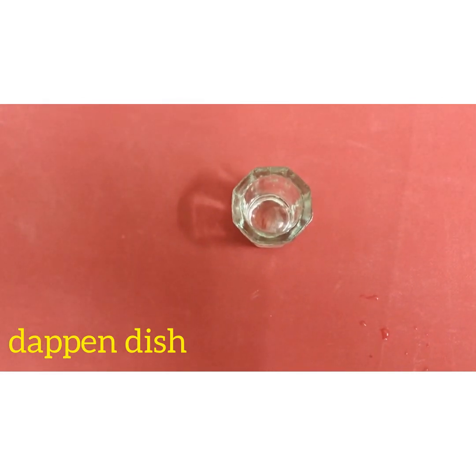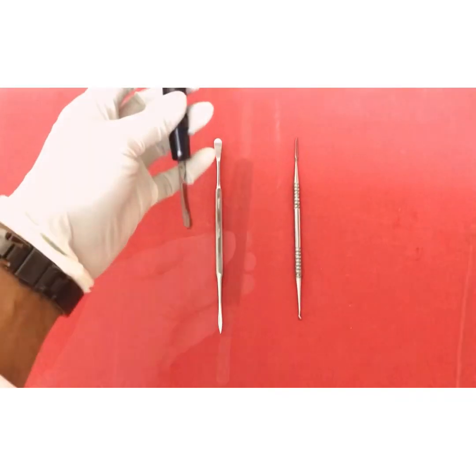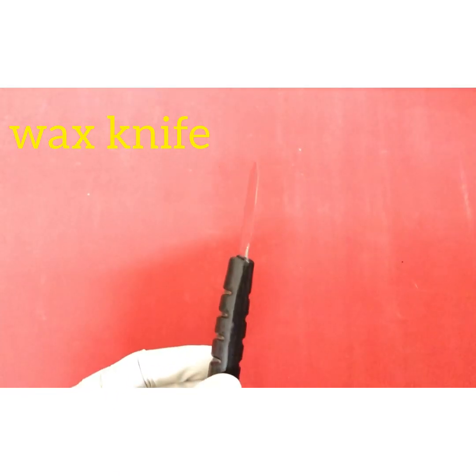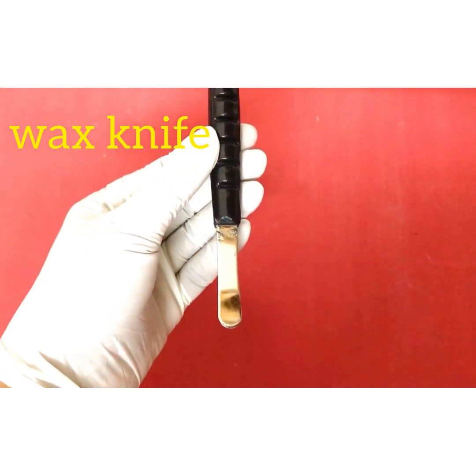These are the instruments used for manipulation of dental waxes. This is a dual-ended instrument called a wax knife. One side is sharp and knife-shaped; on the other we have a smooth flat end.